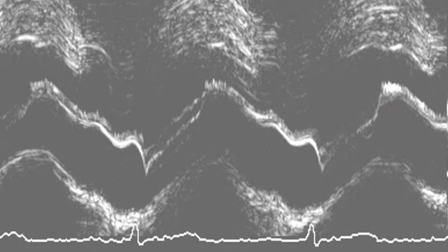Watch the border of the same valve where there is no vegetation, how it is smooth. Completely different from what we see here at the vegetation.